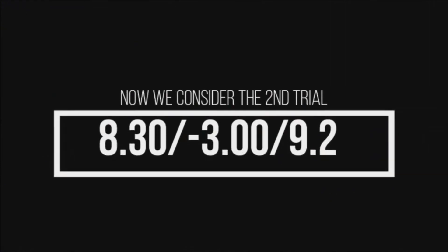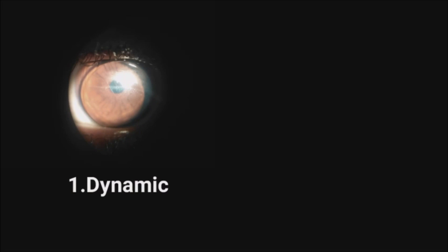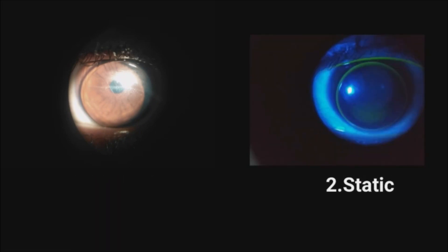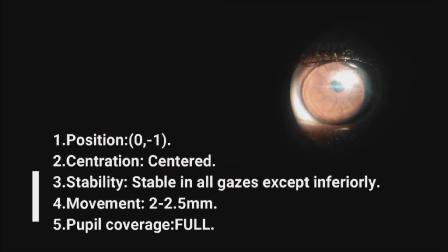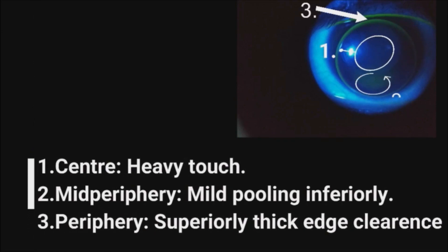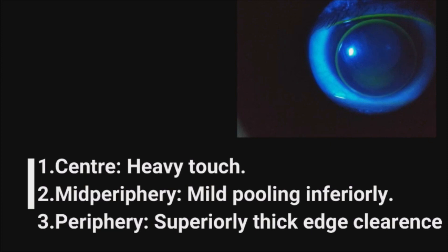Following our findings, the first trial fit is found to be steep, so we move on to our second trial. In the second trial dynamic fit, position is 0-1, lens is centered, there is stability in all gazes, movement is 2–2.5 mm, and there is full pupil coverage. In the static fit, there is heavy touch in the center, mild pooling in the mid periphery inferiorly, and superiorly thick edge clearance. The second trial is found to be flat, so we consider performing a third trial.